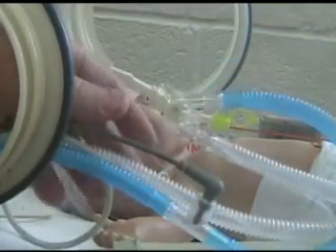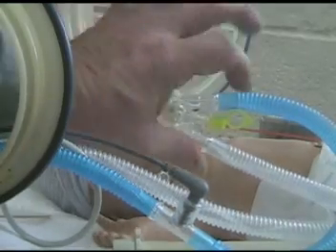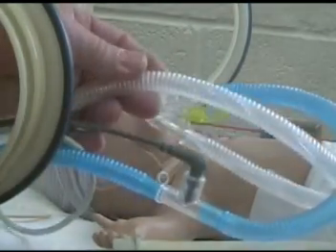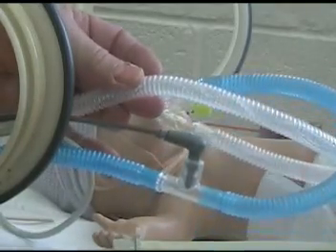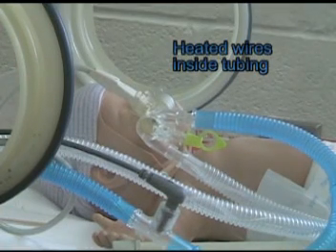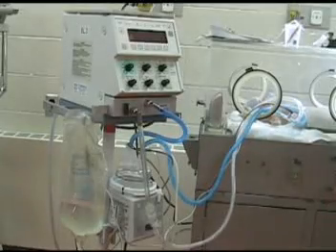So the temperature probe is on the inspiratory side, and then we have the Y-piece and the expiratory line here. Take a closer look at the tubing and you can see that there is a heated wire in that circuit to reduce the amount of water condensation. Let's take a look at the baby log circuit.